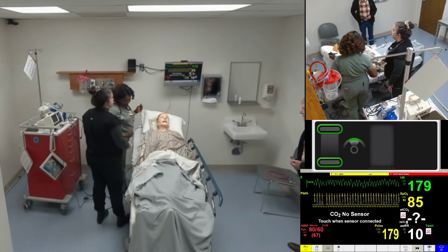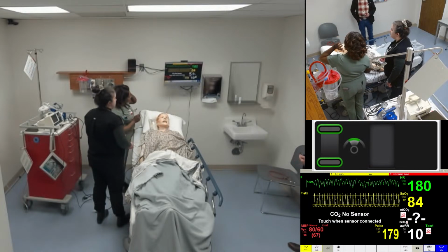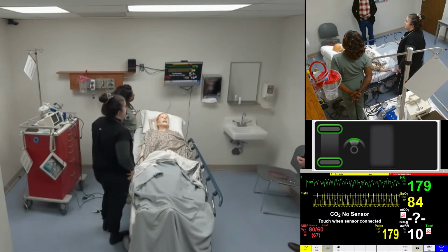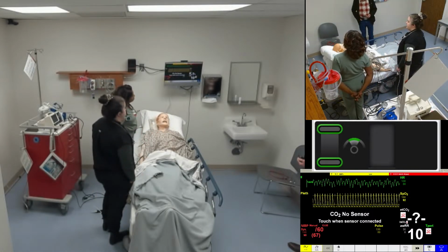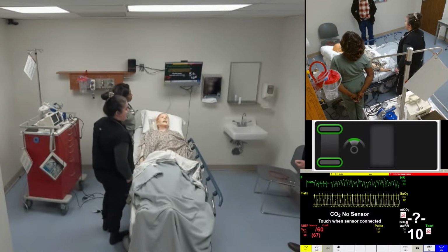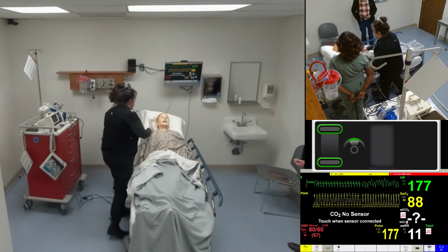It's SVT because of the rate being so elevated, so we could just cardiovert. What is your rhythm? Ventricular. To me, I just see tachycardia of the ventricle. Okay, so it's ventricular tachycardia, and he's hypotensive. What do you wanna do? That's what I don't know. Maybe we could shock him. Ventricular tachycardia, might be a good idea. Just shock him.